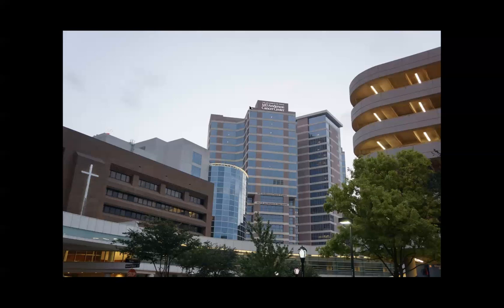Otherwise, with this many pieces of polyp, it is very difficult to convince any pathologist to give you a report of margins are free. Yeah, I was thinking the same thing, because I was thinking, well, if they are able to comment on the margins with this level of confidence, was the original part of the piecemeal EMR the en bloc of the adenomatous portion, and everything else was hyperplastic? Can that be? Sorry guys, they really didn't comment about the lateral margins.